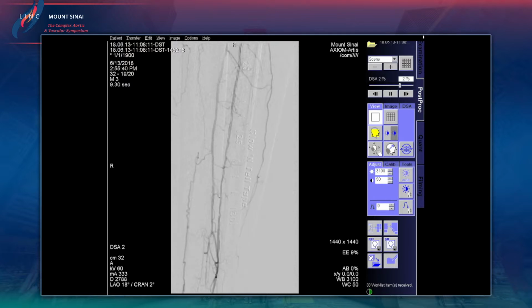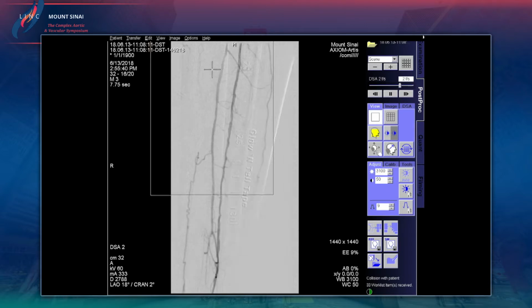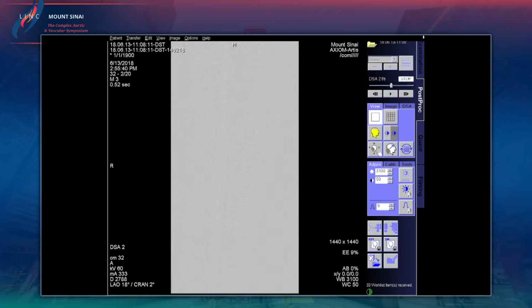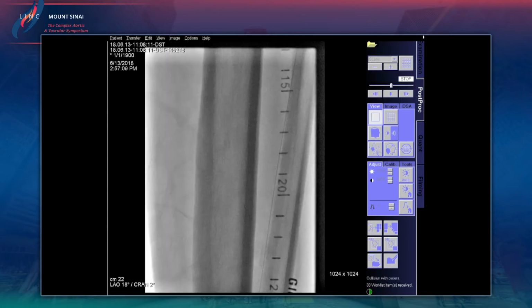Well, that's going to be an interesting discussion as the SAVAL study kicks off. This is a self-expanding drug-eluting stent created for the below-the-knee application. It's a Boston Scientific technology, and it comes, from what I understand, in a length of up to 80 millimeters initially. So it'll be interesting to see what comes from that, because as appalling as that may sound to many surgeons, I would not hesitate to do that. If the results are fantastic, why not? Ultimately, you're not burning bridges, because the distal bypass will go to the dorsalis pedis anyway in a situation like this already.